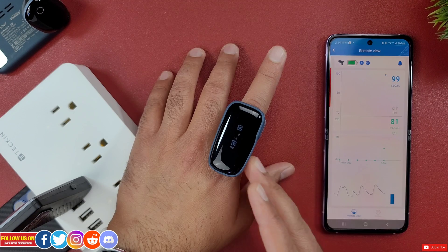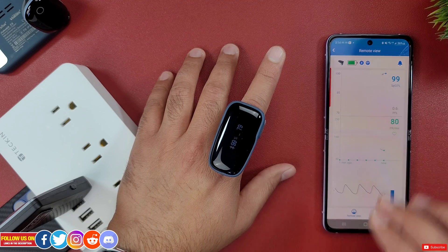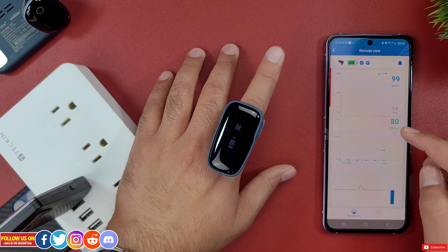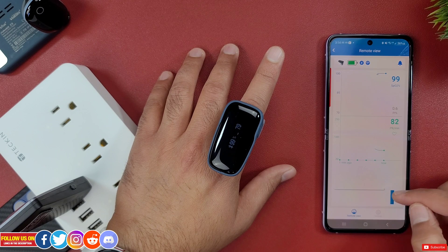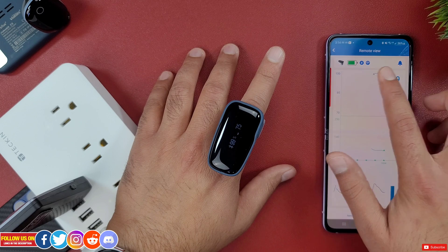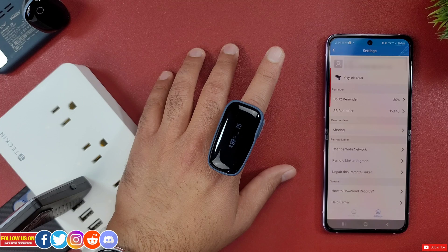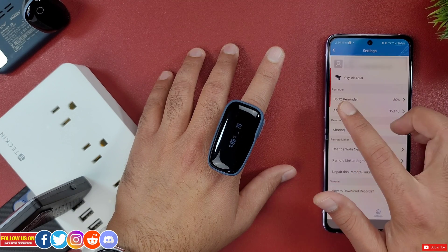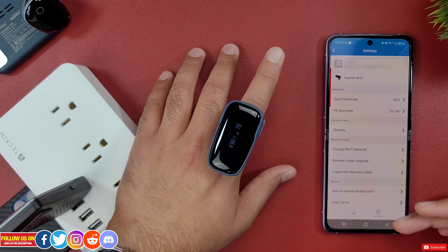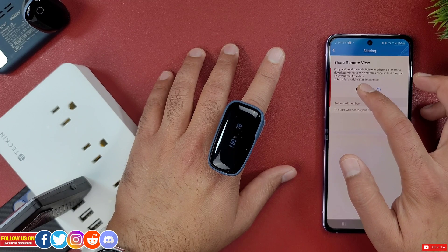Once connected, you can access the remote linker from the V Health app where you can see real-time SpO2 and heart rate data, along with the PI (Perfusion Index), which shows how strong the pulses are at the sensor. At the top you can see the battery level as well as Bluetooth and Wi-Fi connected icons and the notification icon. Under the settings tab you'll find your logged-in account with SpO2 and pulse rate reminders and other self-explanatory options.